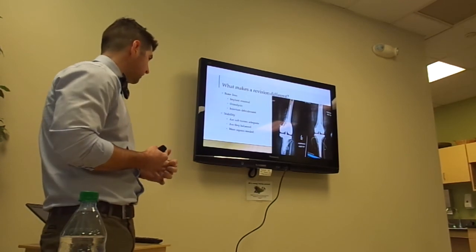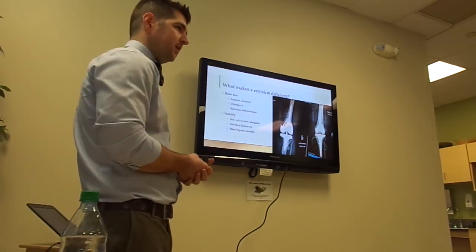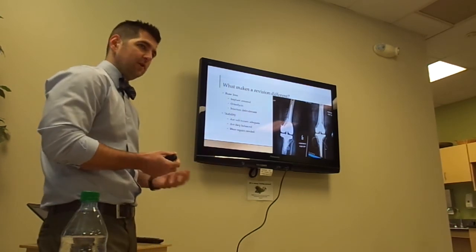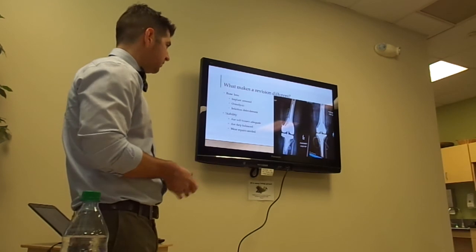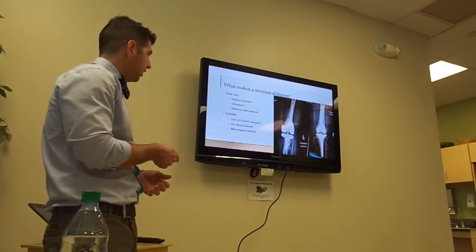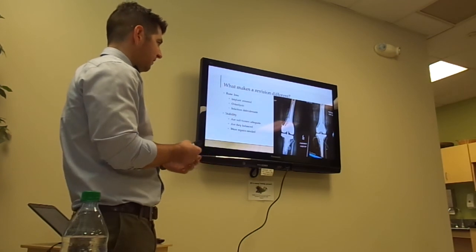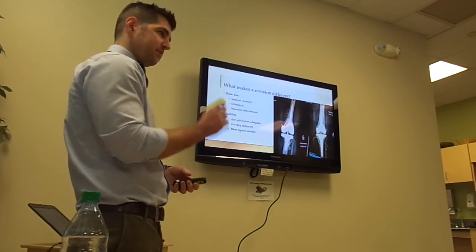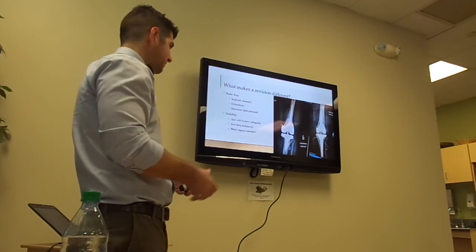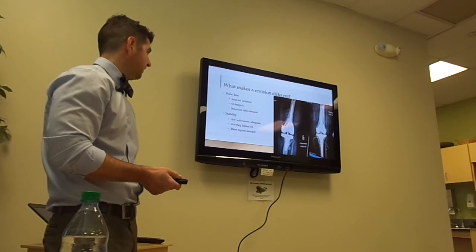Stability. The soft tissues might not be that adequate. I've had a couple hinges that we've done because they don't have collateral ligaments, and so those patients are going to be unstable if they don't have something else from the implant. You can see the little bars in the middle here. These are implants that aren't hinged, but they have a thicker post, so they might have less motion, or occasionally that post is thick and it's also taller, so they might have some patella impingement. Sometimes their motion is going to be limited by that.